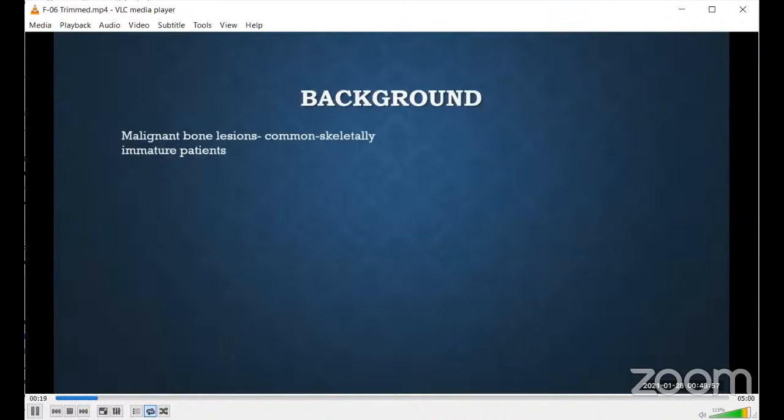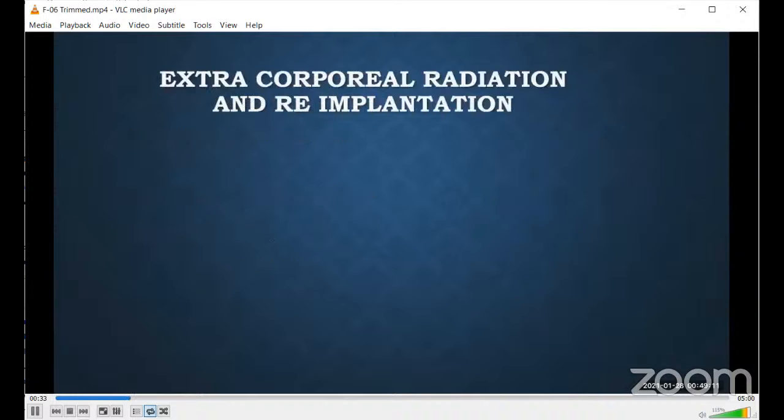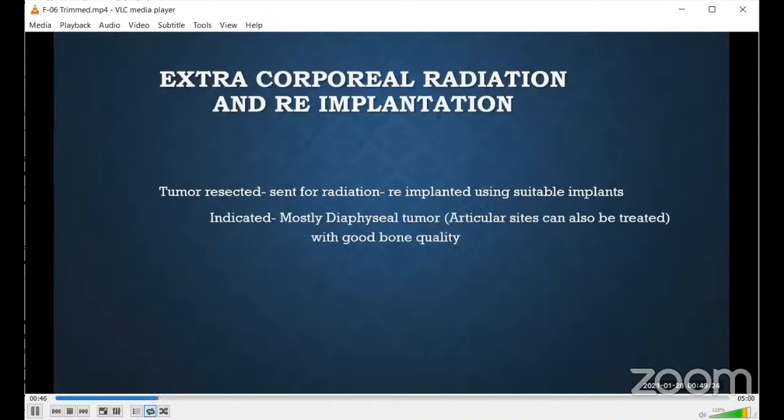As we all know, malignant bone lesions are more common in skeletally immature patients. Limb salvage in this age group is specifically challenging because of the unfused physis. The principle, however, remains the same, that is wide resection of the tumor followed by reconstruction of the defect. Extracorporeal radiation therapy and reimplantation is a biological method of reconstruction where the tumor-bearing bone is reused after radiation and is reimplanted using suitable implants.